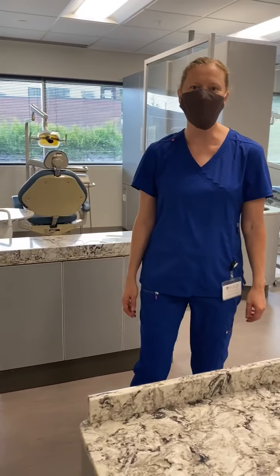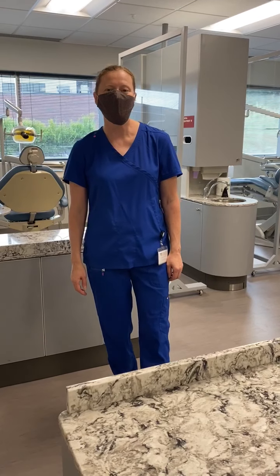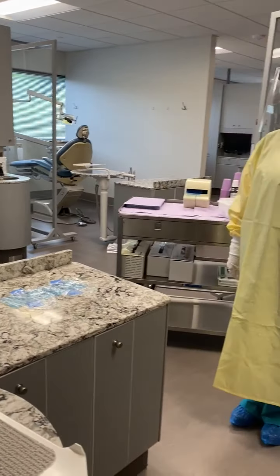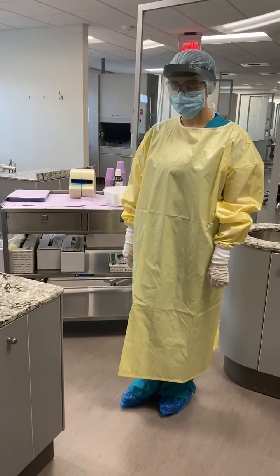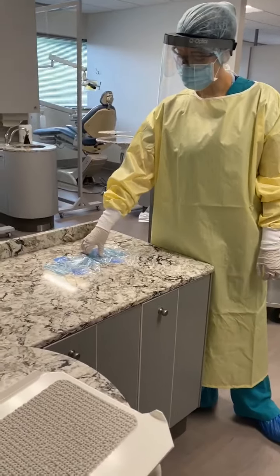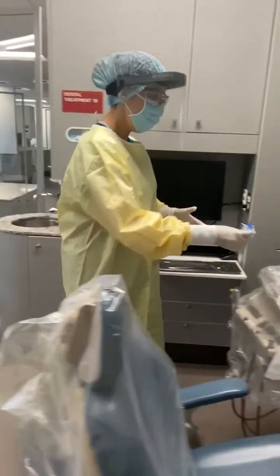Now that you have seen your patient, it is time to break down your unit. The first thing you're going to do when you break down your unit is your full PPE will still be on, but you will start taking all of the barriers off and placing them on the bag on the bracket table.